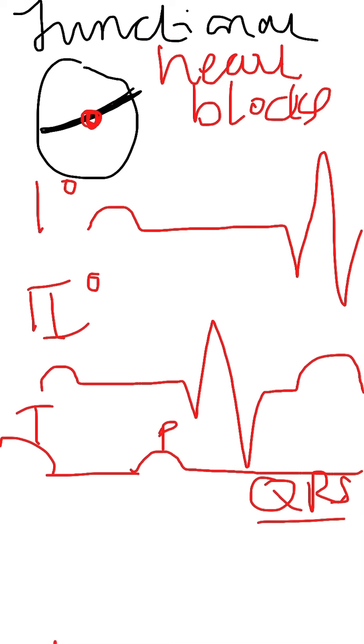This is the principle, that there is no QRS that is formed because of this P. So I want you to go to Ganong and read on Mobitz, Mobitz 1 and Mobitz 2, all right, and see how these patterns can actually be different.